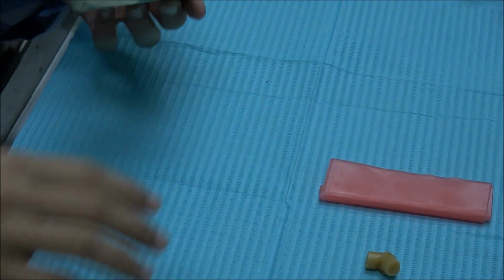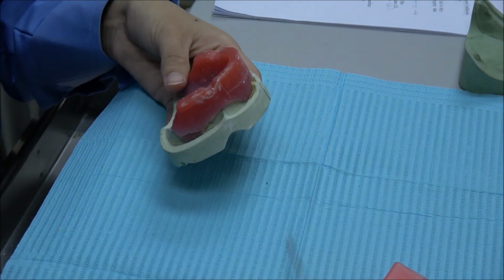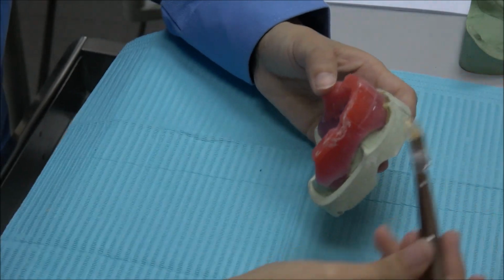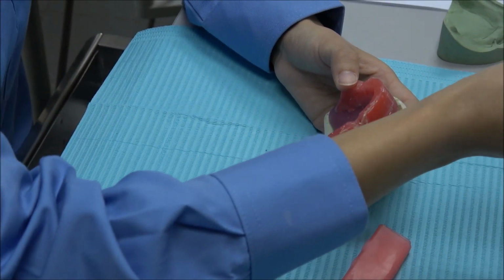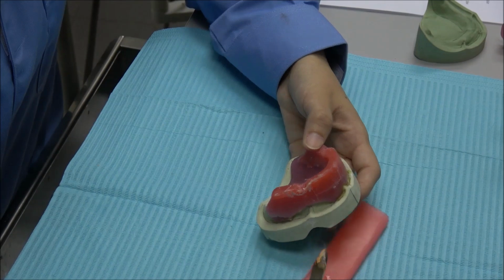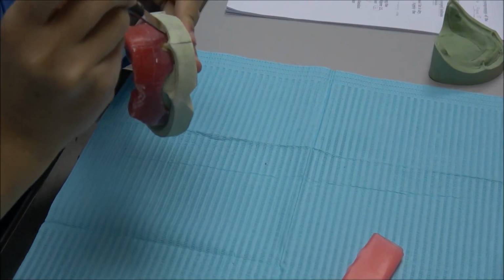Okay, so we are sealing it now. I'm using the modelling wax. It's easier because later on it is easier to remove from your models. Okay, so using your wax knife to pick up your wax, around the circles.